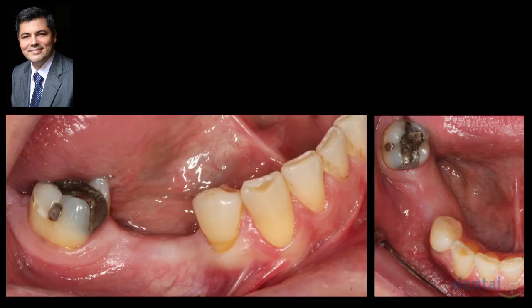So now, a surgical guide is fabricated, and we bring it to the patient. This is a patient that for several years has been missing one premolar and a molar. My patients are clenchers and heavy bruxers, because my practice is a TMJ practice exclusively, and we do implants on the TMJ patients. So it's a situation that sometimes gets interesting, because a contraindication for immediate loading is parafunction.